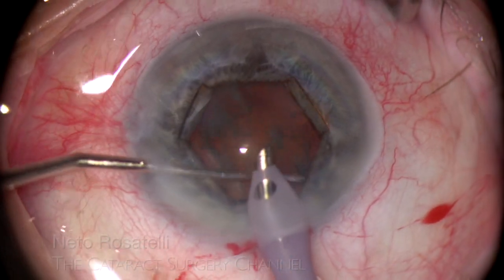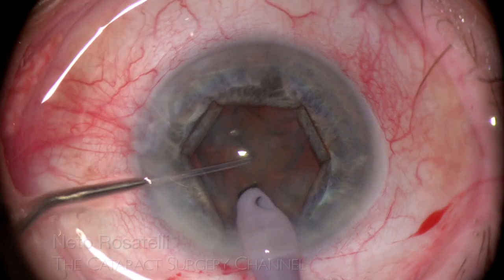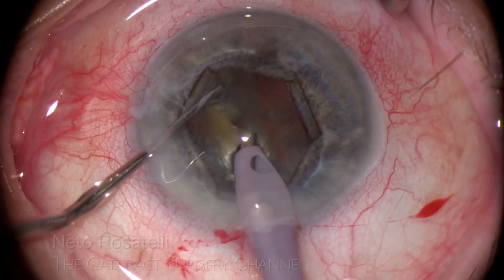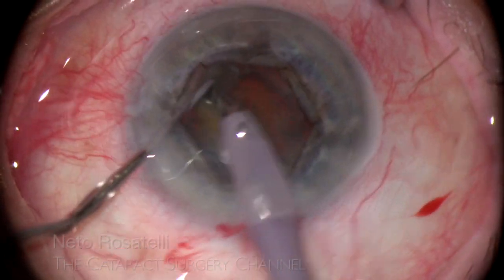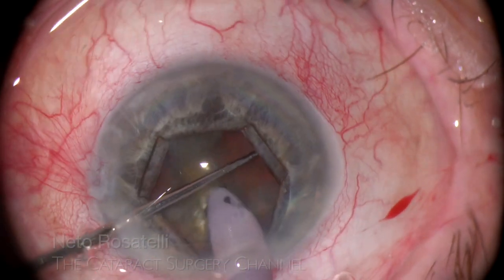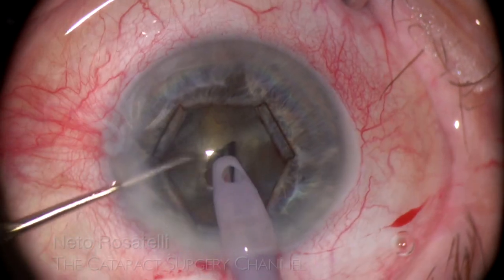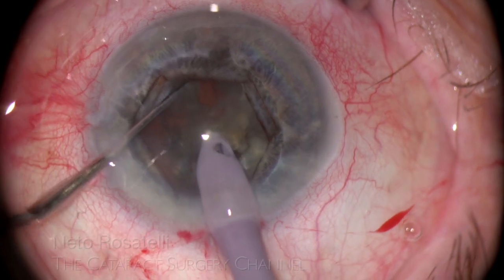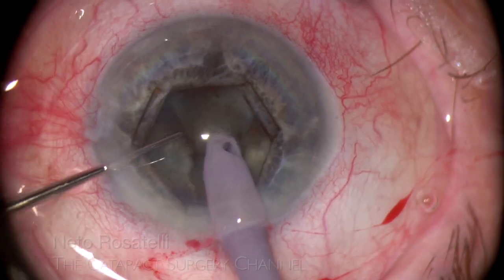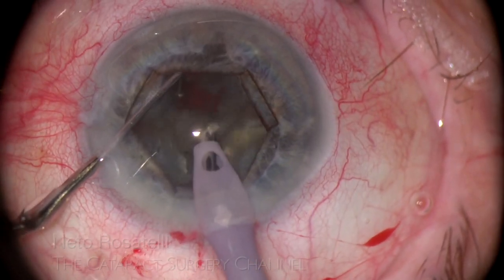Indeed, the bag is too loose to attempt nucleus rotation — if attempted, it will damage the remaining zonules. A first crack is achieved and it's clear that nucleus rotation is impossible without zonular damage. A transverse chop is made to liberate a fragment without rotating the nucleus and I begin nucleus disassembly. I am sure now this is a lost bag and I hope to succeed in getting all the nucleus without dropping something. Patience and care are the way to go here.